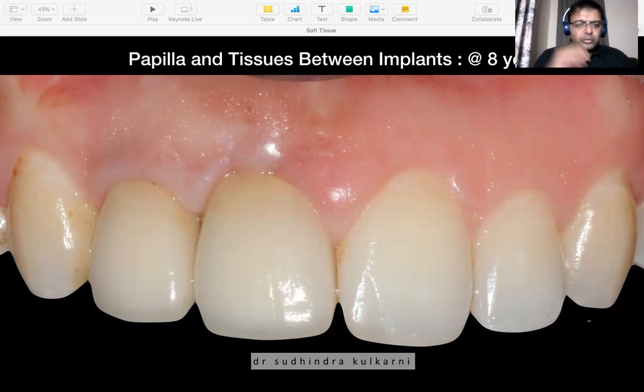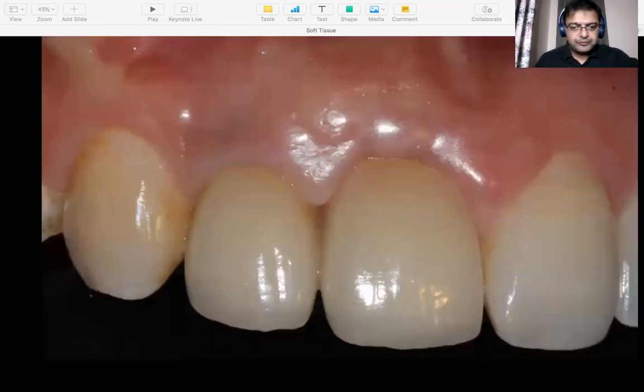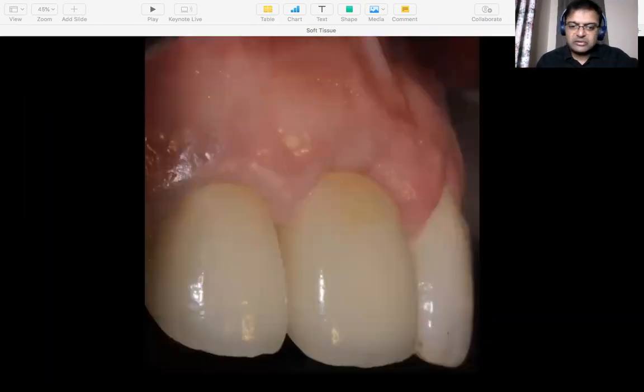But if you actually take a closer view, though the stippling has increased, you also see small scar lines, a small reduction in the tissue bulk that's happened exactly at the gingival margin in relation to the central incisor. And this is what I again tell: the peri-implant mucosa is a scar tissue, and this undergoes a continual reduction in bulk. So that's how it looked at cementation, where you had much bulk, less stippling, whereas at 8 years the stippling has increased, but the bulk has considerably reduced. So I would probably look at doing a soft tissue graft in this area 5 more years down the line from now. But the emergence and everything looks just fabulous.